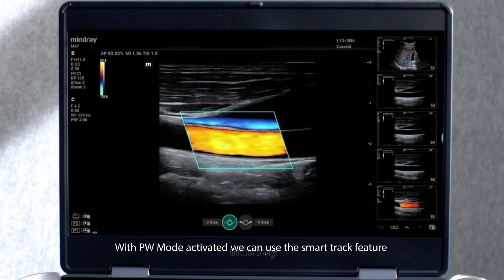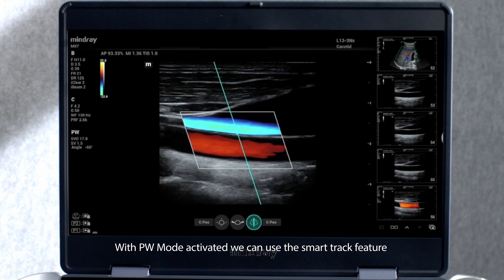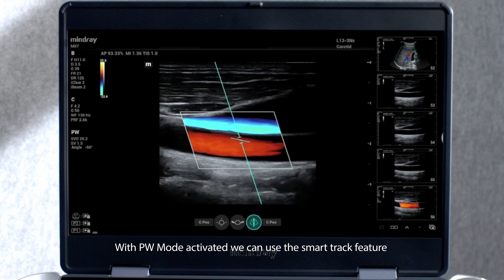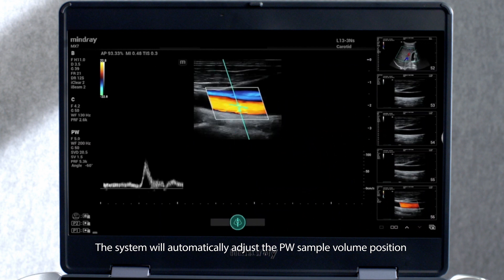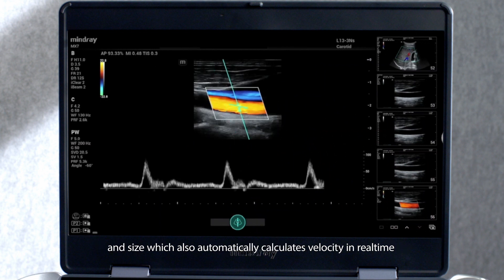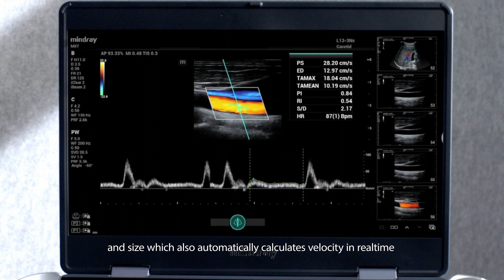With PW mode activated, we can use the Smart Track feature. The system will automatically adjust the PW sample volume position and size, and also automatically calculates velocity in real-time.